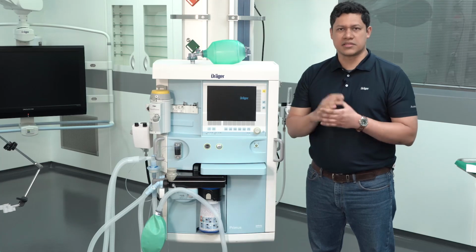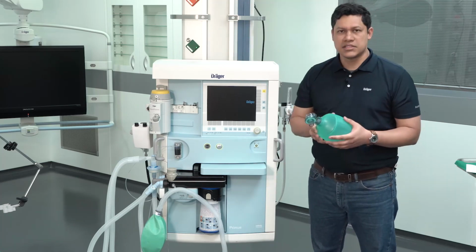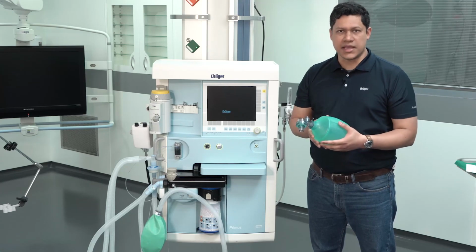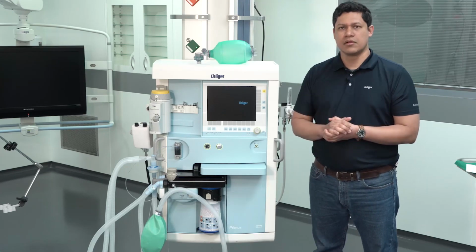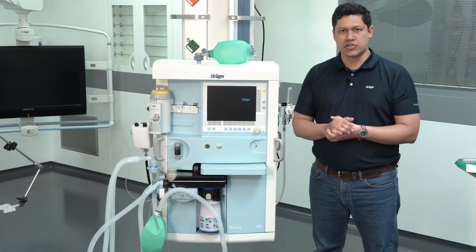A separate external manual breathing bag should always be in the workplace. This is to secure patient ventilation in case of any failure. For non-invasive ventilation, an ICU mechanical ventilator or a non-invasive ventilator should be preferred.